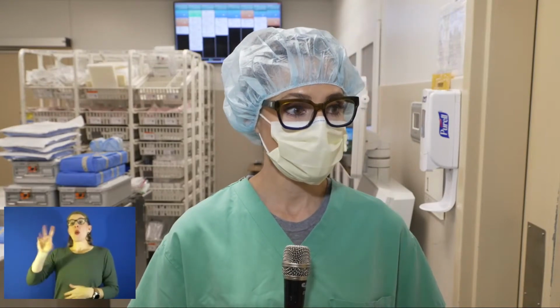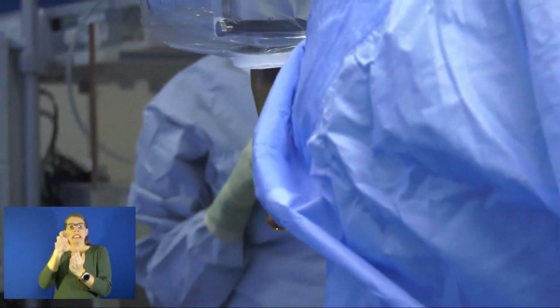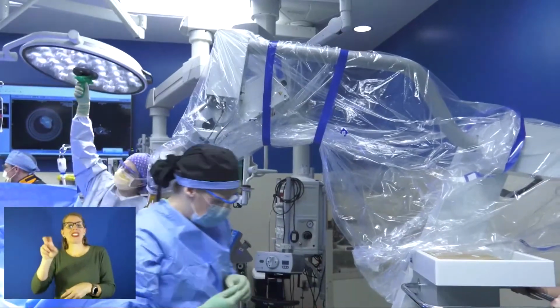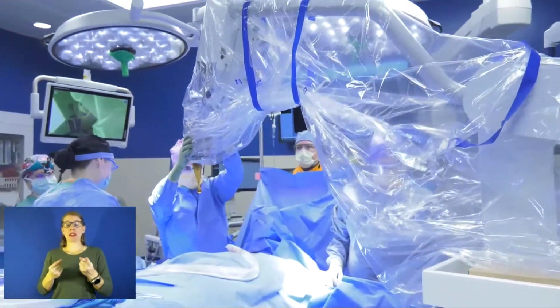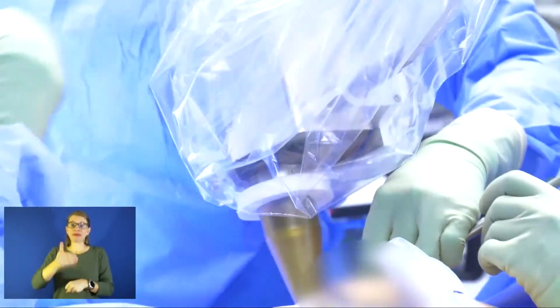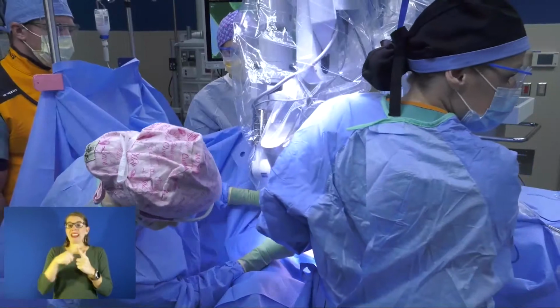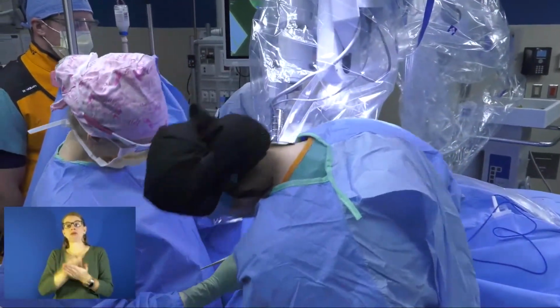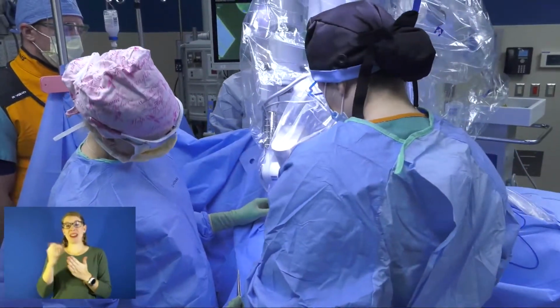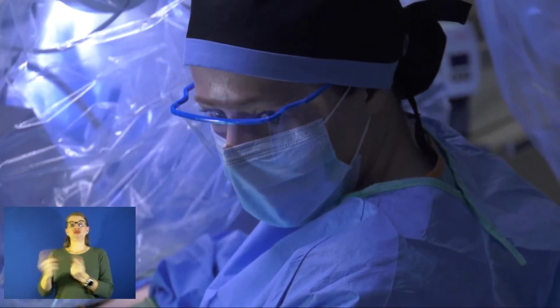And here's why. They're going to use this IORT therapy to treat the cavity after they remove the cancer. And the hope is that it is small because they caught this early. They will give it a dose of the radiation. And what they're doing in here right now will hopefully eliminate any need for those daily radiation appointments that we all know, breast cancer warriors who've had to go through this. They have their cancer removed and then they have to go back for the radiation 1 hour a day, every day, for weeks and weeks and weeks. The hope is this eliminates that. So Leanna can go back to life and be up and at 'em and doing her thing and not have to travel back and forth and get that radiation treatment.